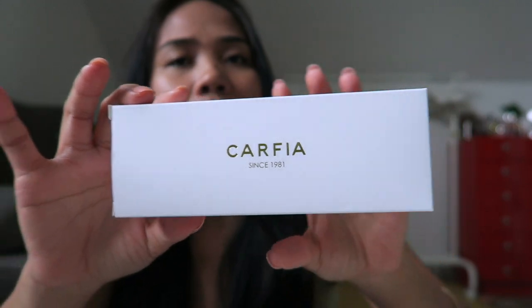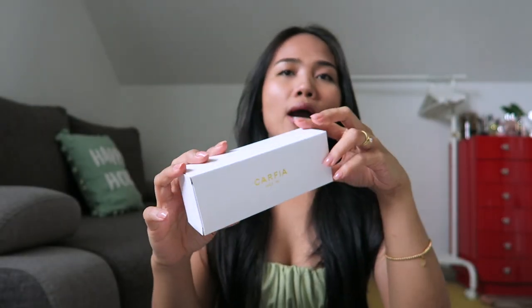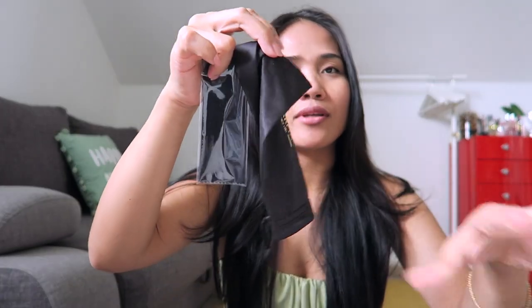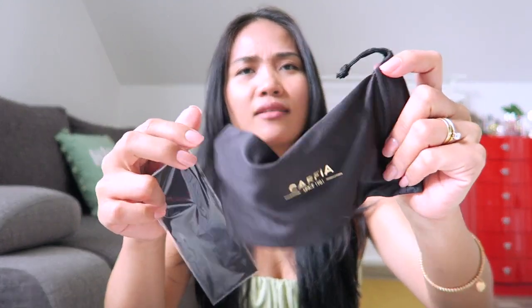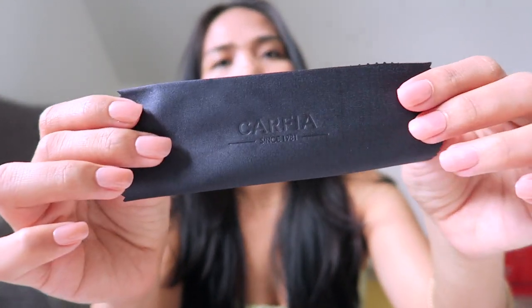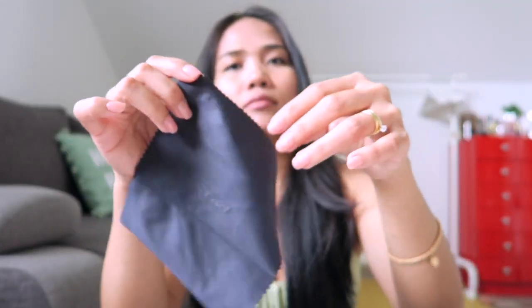It says here Carfia, since 1981. I chose a prescription glasses called Fresco. This is the dust bag — it also says Carfia. They also have an eyeglasses cleaner cloth, which also says Carfia. The eyeglasses is stored in plastic but the packaging is hardbound.